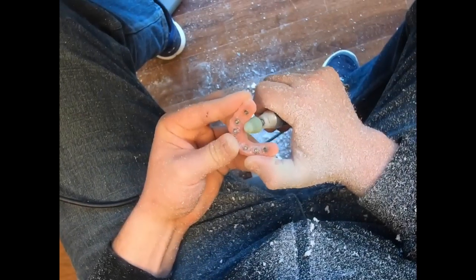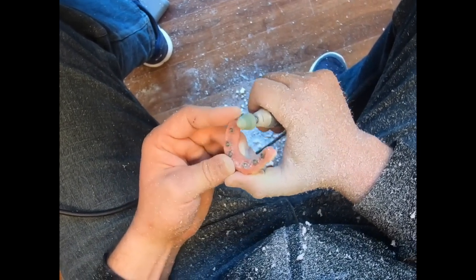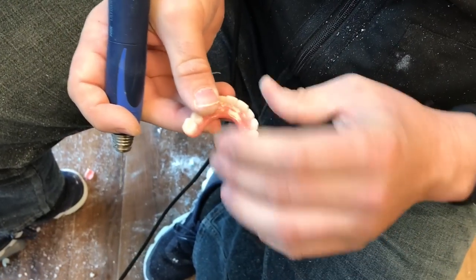Once we've finished the bulk reduction, we'll go ahead and just start with our initial polish, and then we're going to add acrylic to the intaglio surface to establish hygienic contours.